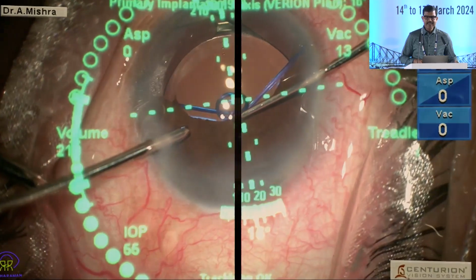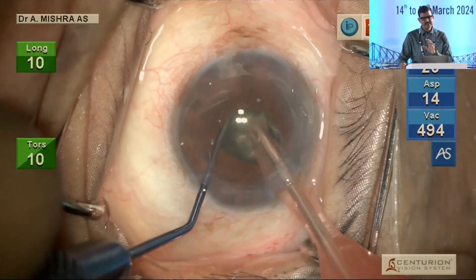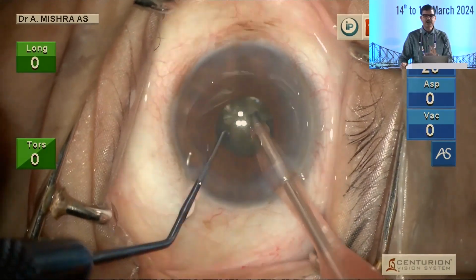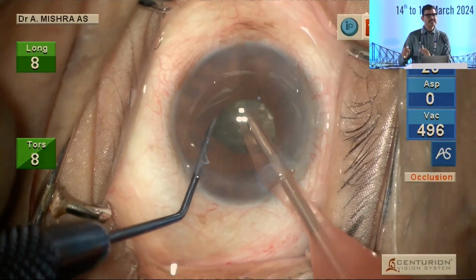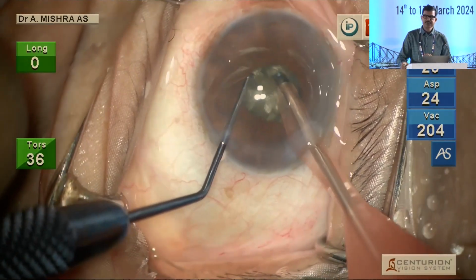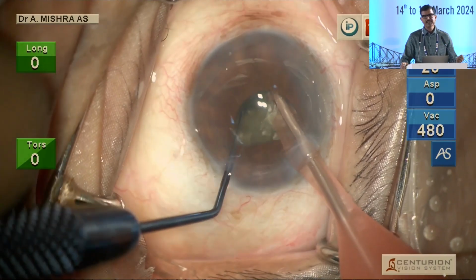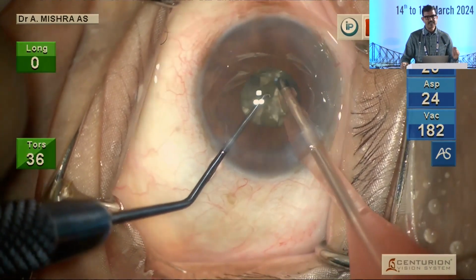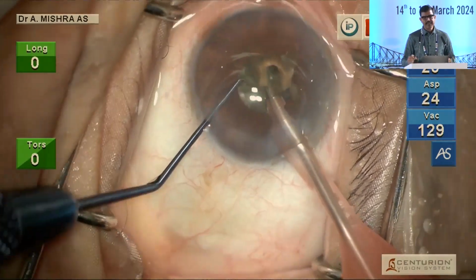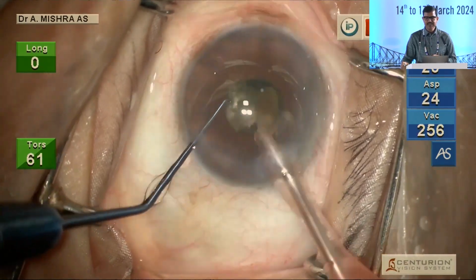But finally, all that being discussed, the final thing is managing the nucleus without any device. Because all these devices, since they stretch the pupil, the perfect geometry and the sphincter function, the aperture function is never restored to its normal capacity in the post-operative period. So whenever we can, we should be trying to manage the nucleus without attaching any device to it.